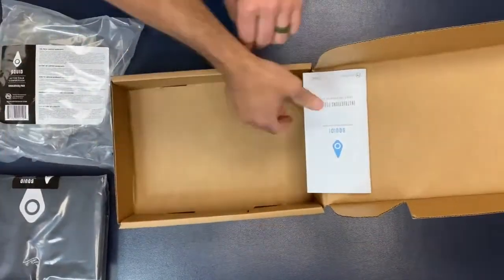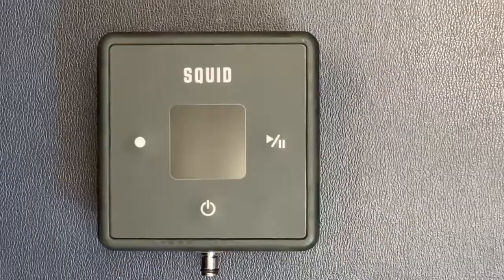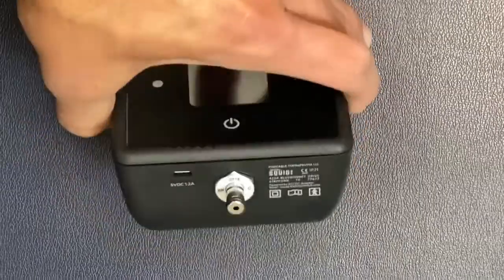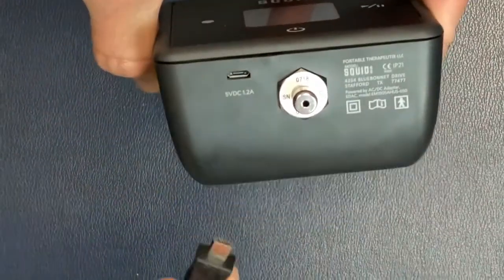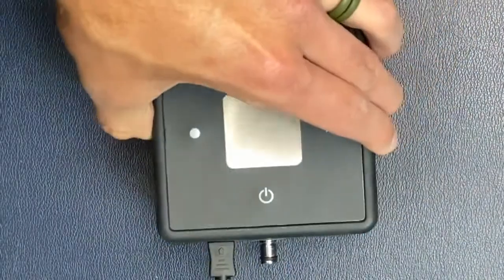A user manual and a quick start guide. Please be sure to read the manual and refer to the quick start guide before use. Before using the Squid Go for the first time, you will need to charge the control unit using the provided charger. Let the unit charge for about 8 hours or overnight.